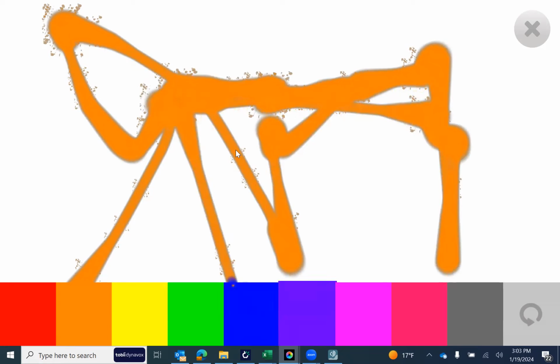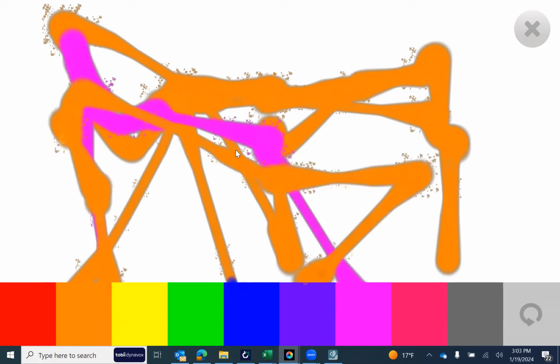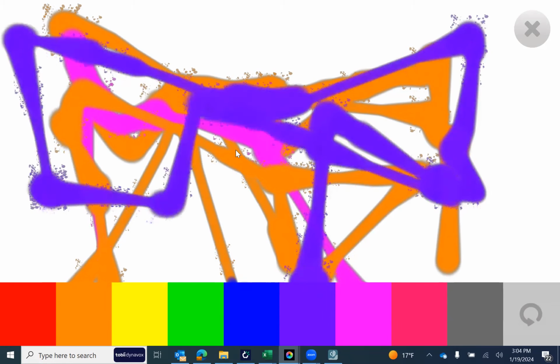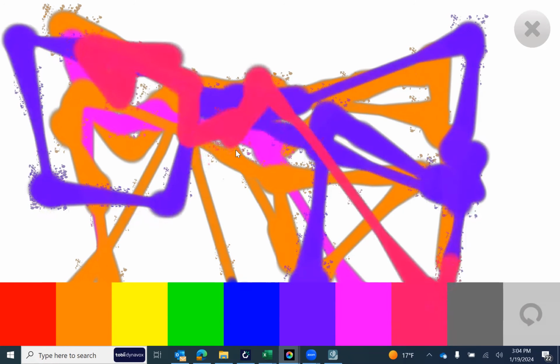All right, I'm done with orange. I'm going to go choose pink or purple. And looking around, when I look down at that menu down below, then it's going to change my color. And again, the possibilities are endless here. So you could work on finding a particular color, trying to draw a particular shape with your eyes on the screen. Then you can take screenshots of these and save them, print them, put them on the fridge.